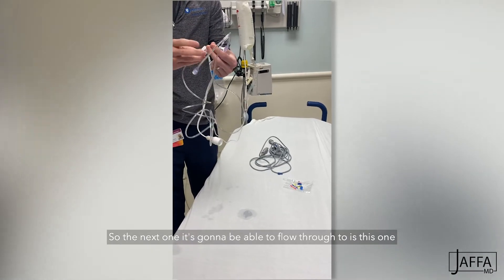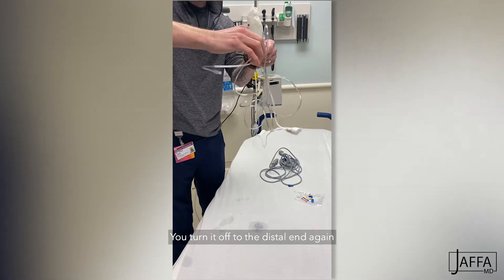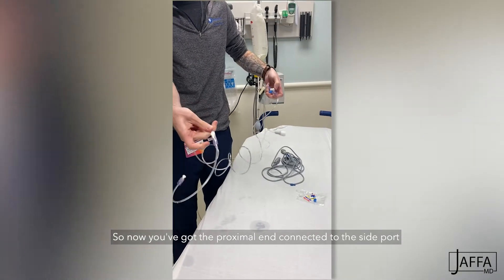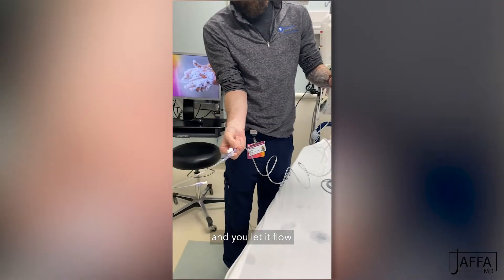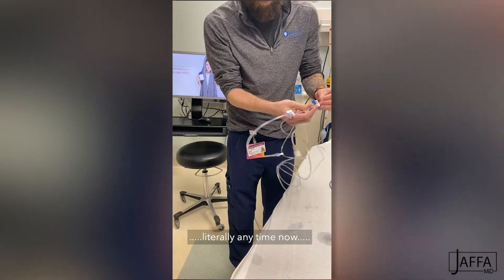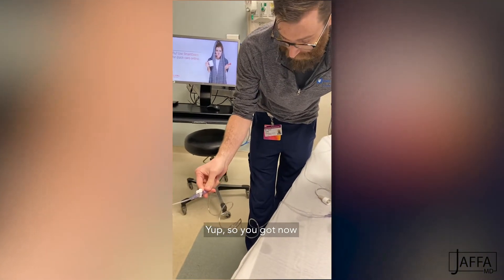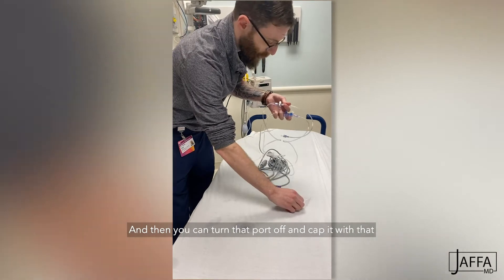The next one that's going to be able to flow through is this one. So you take that white cap off and turn it off to the distal end again. Now you've got the proximal line connected to the side port. Pull the little squeegee again and let it flow until it comes through — there you go. Then you can turn that port off and cap it.